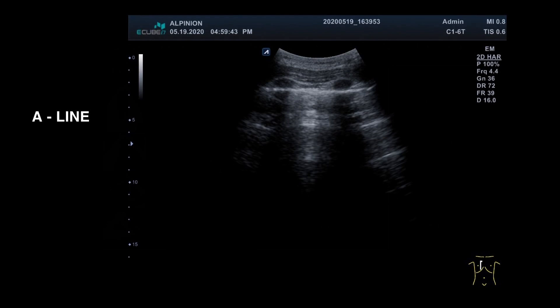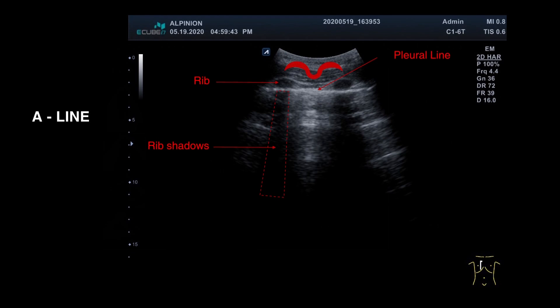With lung ultrasound, you should find a pleural line and the ribs. The pleural line is a single hyperechoic line, and rib shadows stretch to the bottom of the image. These lines and ribs should make a bat sign. You can find reverberation artifacts originating from the pleural line, which are called A-lines. These repetitive horizontal lines are spaced the same as the distance between the skin and the pleural line. A-line is a normal finding of a lung.